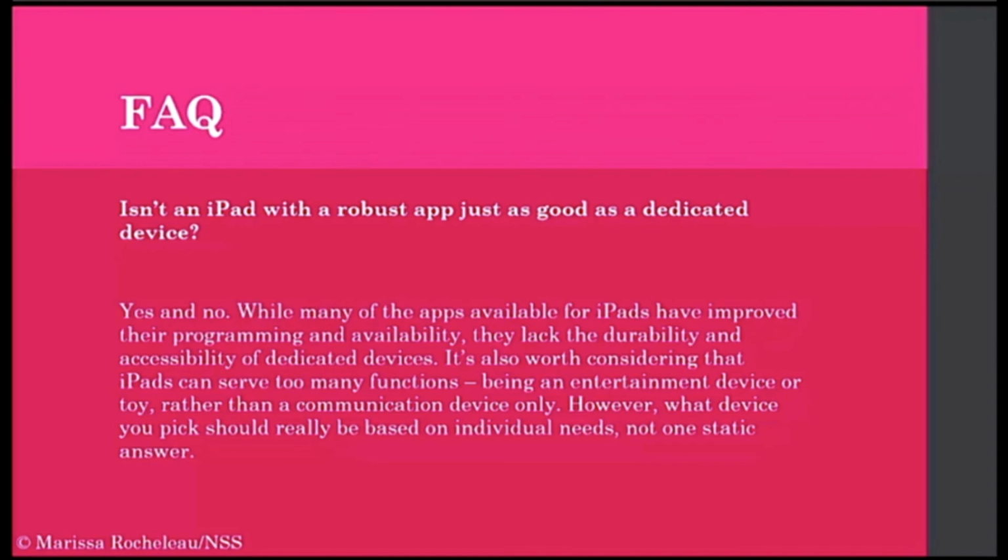I also think it's worth considering that iPads can actually serve too many functions. And you get into this a little bit with high-tech devices, but it's easier to restrict access to certain things or just not use those features if the client isn't ready for them. If somebody's not using their device to turn on and off lights, you don't even need to access that part of it. But iPads are so easily seen as entertainment devices or just toys rather than specifically being a communication device.